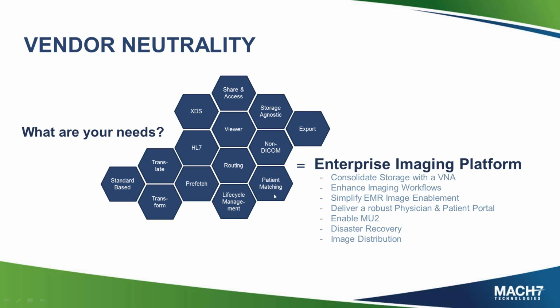Almost done here, but I'll talk through a couple more. Another core thing I think most VNA vendors do support really is storage agnostic. A VNA vendor shouldn't care if you have IBM storage or EMC or NetApp or HP or whoever it may be. Does that VNA vendor provide capabilities to work with any number of different storage devices? And with that storage device, what are its levels of capabilities from a storage management perspective? Does it enable you to move between different storage tiers and so forth?